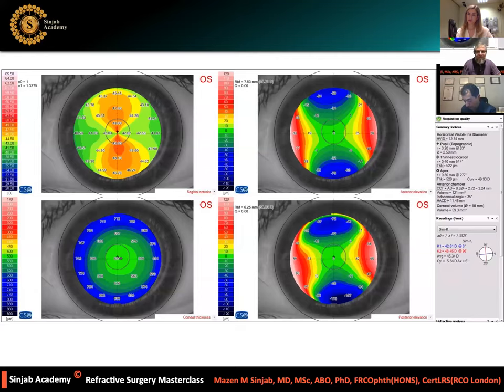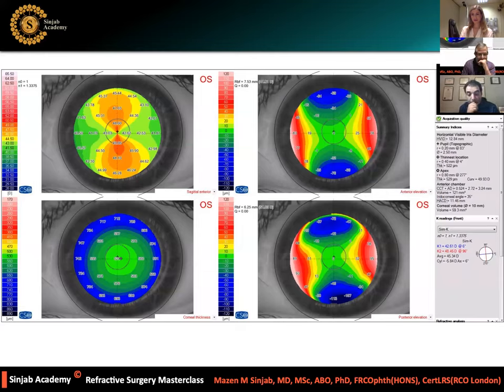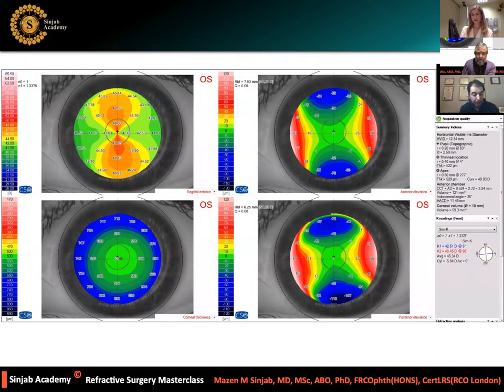Final case: a cornea with symmetric high astigmatism — this is a normal cornea. Even if we have symmetric high astigmatism, it might be a completely normal cornea. It is not necessarily ectasia or keratoconus.